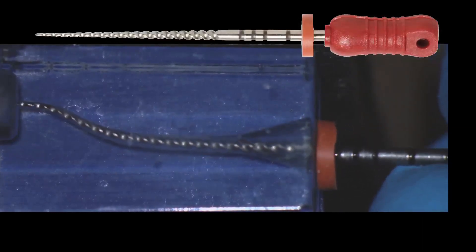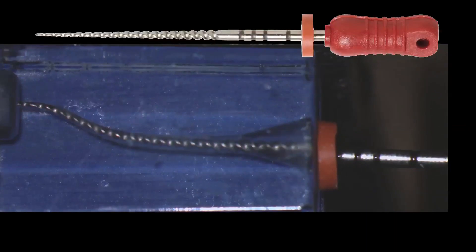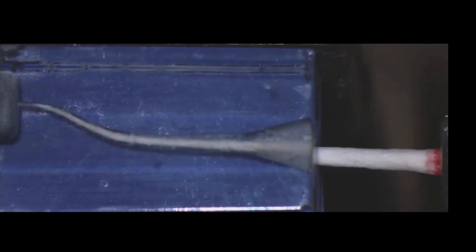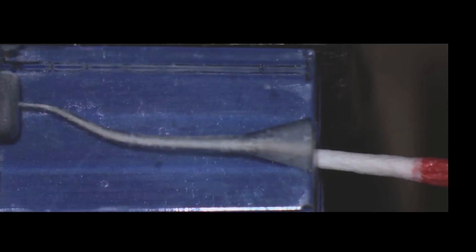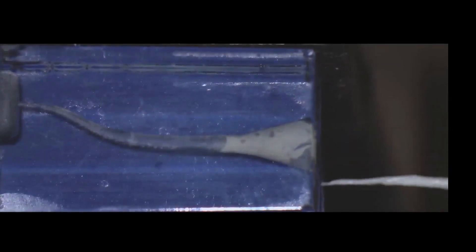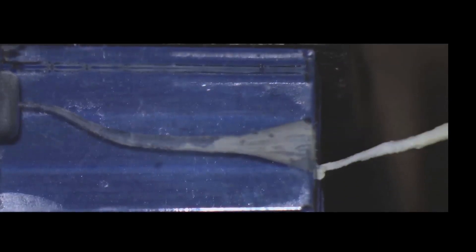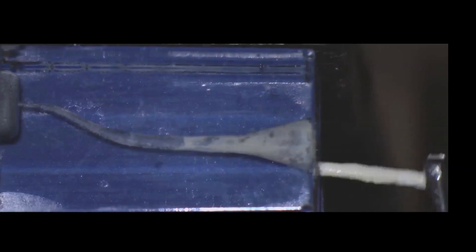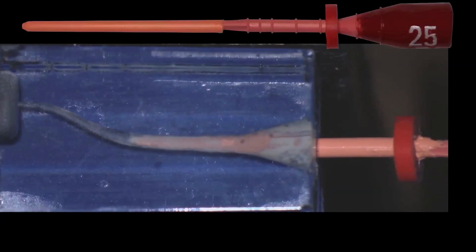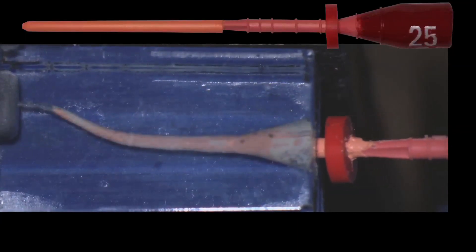Now we are verifying with a size verifier that we have sufficient space in the canal to receive our core material for obturation. We dry the canals very well. After drying, we need to place some cement — a very fine layer — at the entrance of the canal, then remove the excess. We use cement and then insert the core obturator until it reaches working length. You have seen how easy it is to fill the canals with Gutta-core.